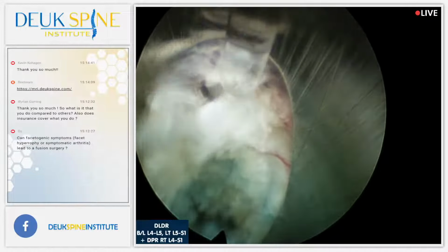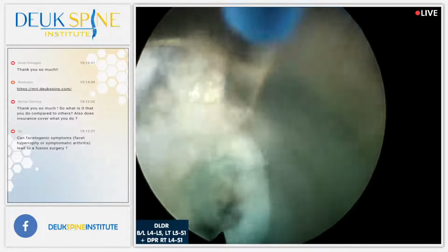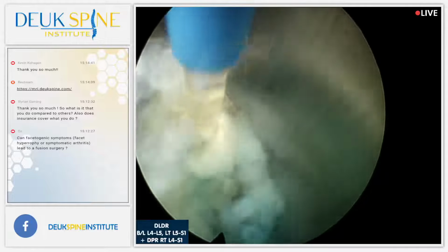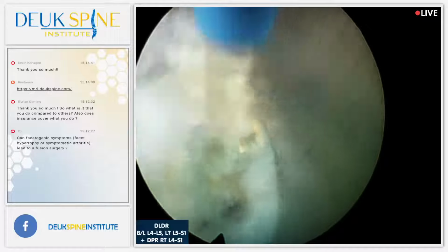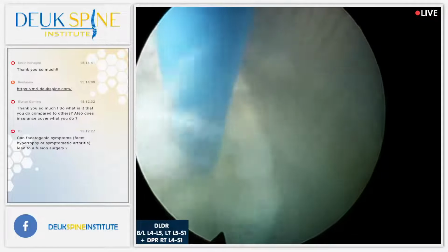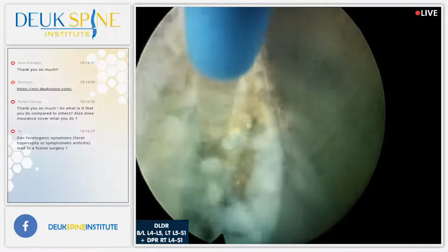There's the tear right there. You guys see the tear, Henry? Look at that thing. Yes, we do. And you can see the herniation stuck in there, the blue. That is the source of this patient's back pain. He's had it for 40 years. Folks, don't be like this patient. Don't wait and suffer with 40 years of back pain before you come here and we get rid of it. We literally will get rid of it in 1 hour.